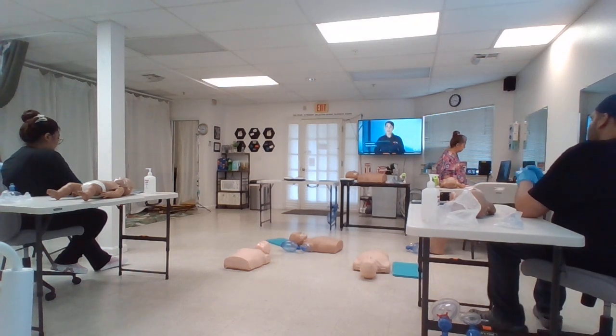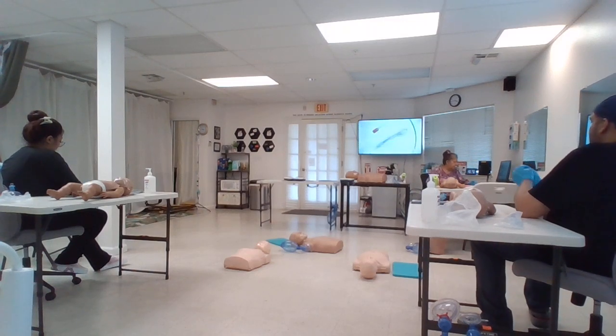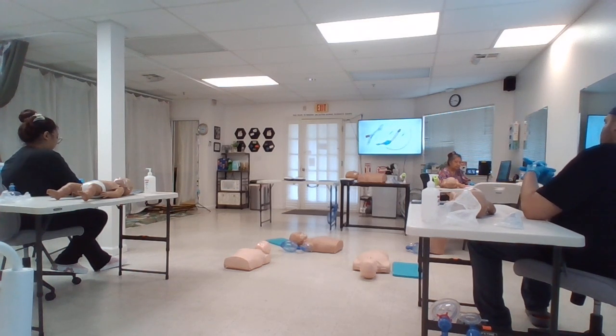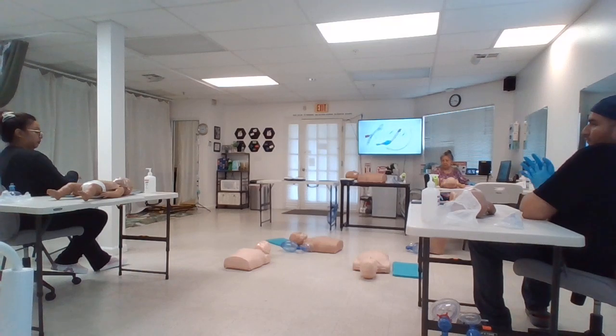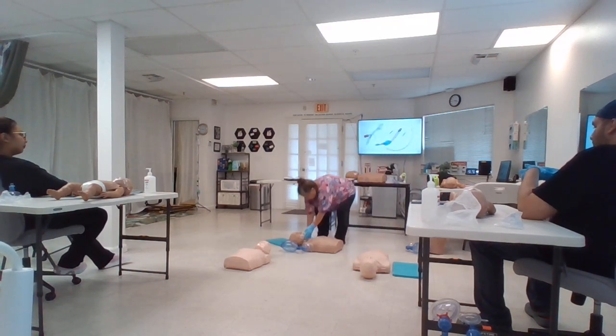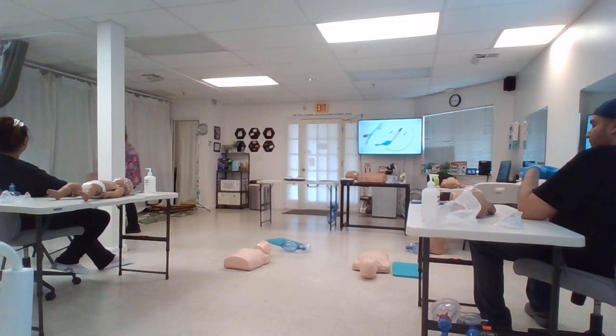Another way to deliver breaths is with an advanced airway. Devices such as laryngeal mask airways, supraglottic airway devices, and endotracheal tubes are types of advanced airways that are more secure for providing breaths. These devices help prevent gastric inflation and airway obstruction. Placing these devices requires special training that we won't cover in this course, but you should know how to give breaths when an advanced airway is in place.